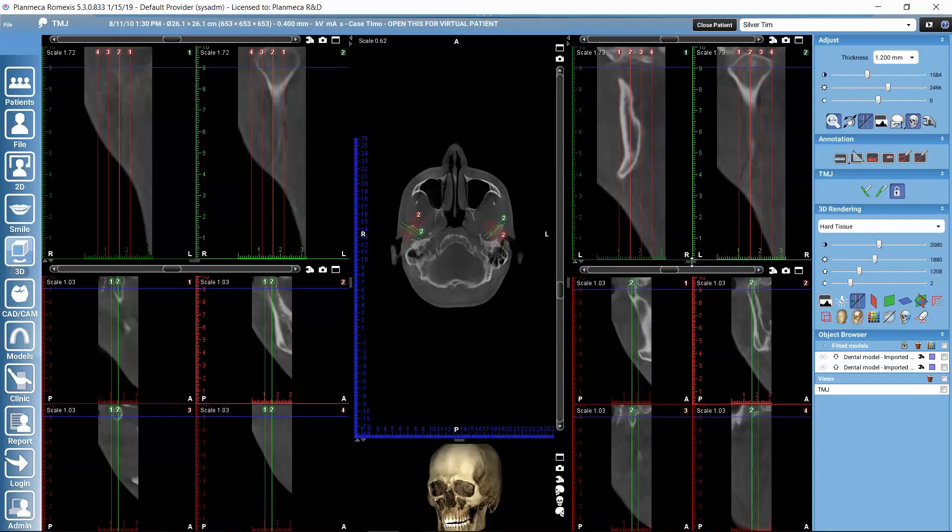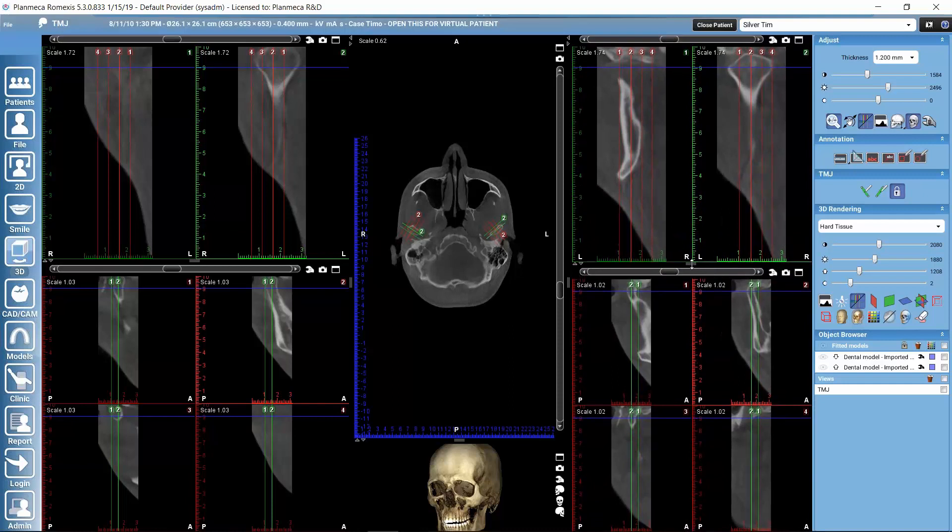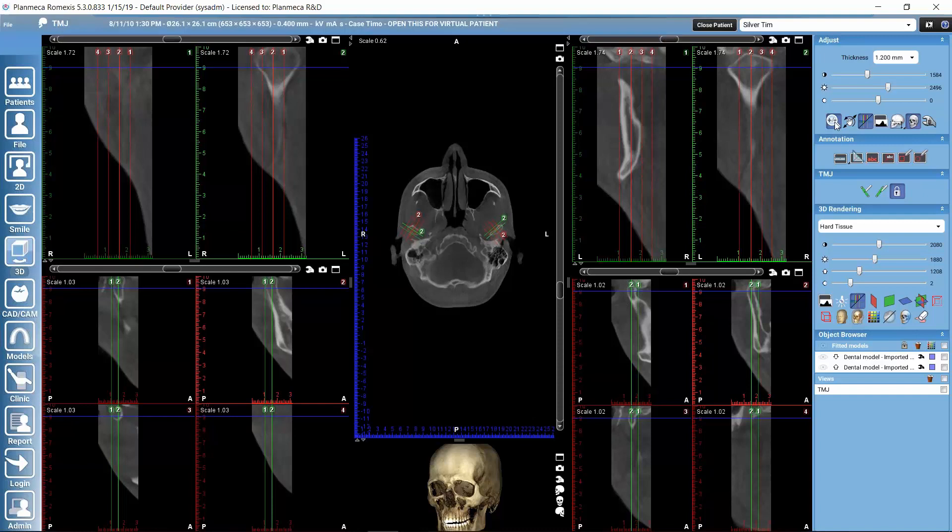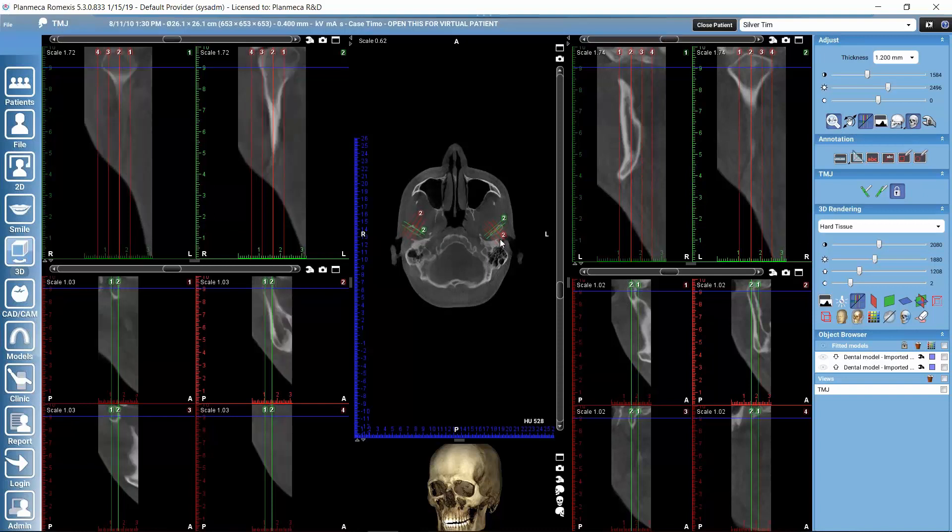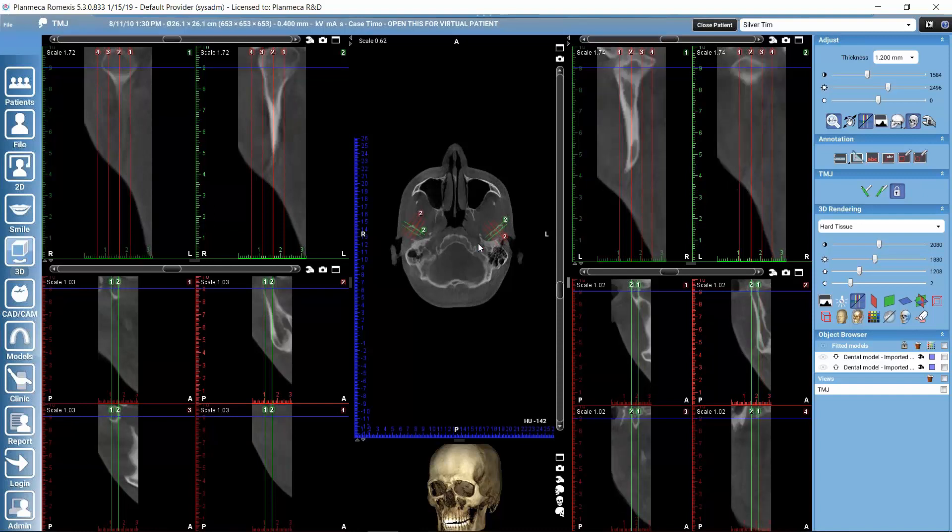By the way, we can use these small icons here in between the views to change the relative sizes of these slice views. We can build the kind of view that we would like to have here. And we can still adjust from where these slices were taken. If we have this tool deactivated, this move rotate volume, we can basically simply grab these lines here on top of the condyles and we can move them to a more suitable position when needed.